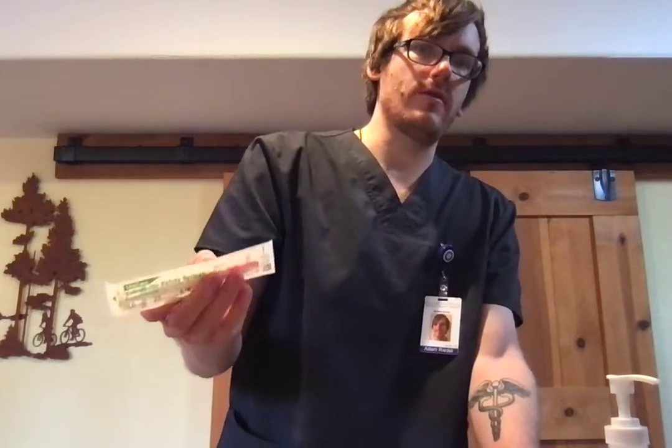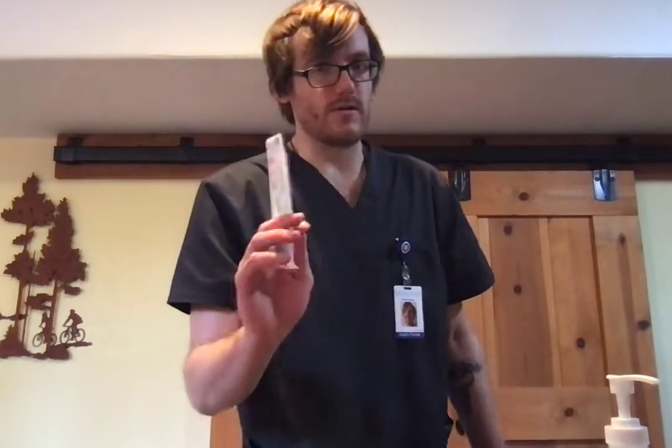This is my BSN225 Subq remediation video. For this I need a few things: my pretend patient pad, my syringe and needle. In this case it's going to be a 25 gauge 5/8 inch. You can have 1/2 inch to 5/8 inch, and then 25 to 27 gauge. And then this is a milliliter syringe as well.